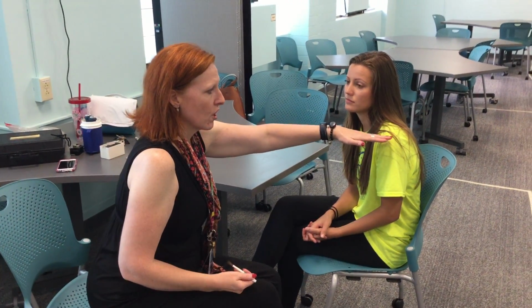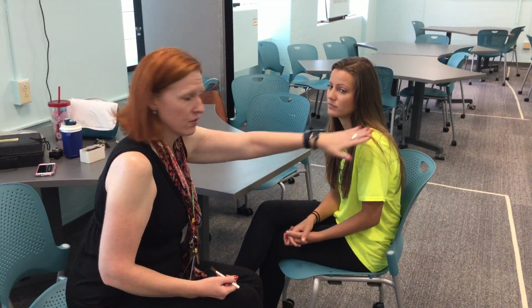So the first one I'm going to administer today is light touch. I have two different things here because my cotton ball looked kind of crazy. I have a little brush, so it's just going to be like a little tickle, but you can use a cotton ball, a Q-tip, anything that has a soft, fuzzy feel to it. And when working with an individual, you will always start proximal to distal, so from shoulder to wrist, hand.